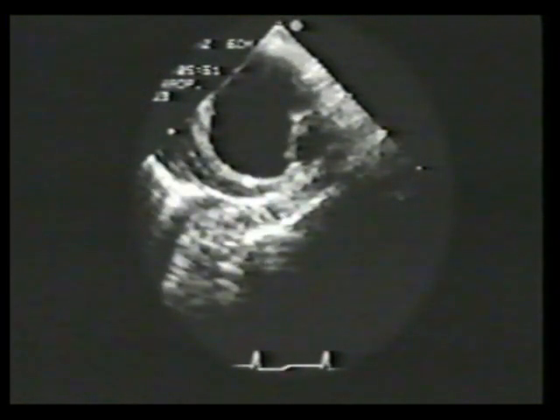In real time, you saw a small, mobile thrombus within the lumen. The probe has now been advanced to 30 centimeters, and we identify even more worrisome pathology. Atherosclerotic plaque has been lifted, and blood has dissected beneath it, penetrating the wall of the aorta. This is adventitia. These penetrating aneurysms carry a high risk of complete rupture. A prompt surgical approach is generally indicated, particularly if associated with symptoms such as back pain.